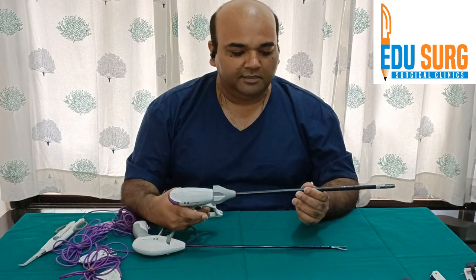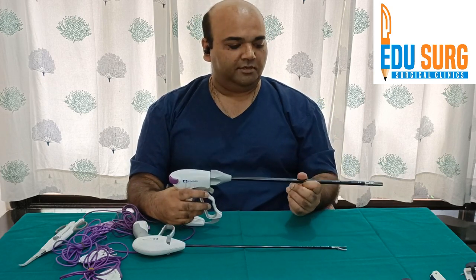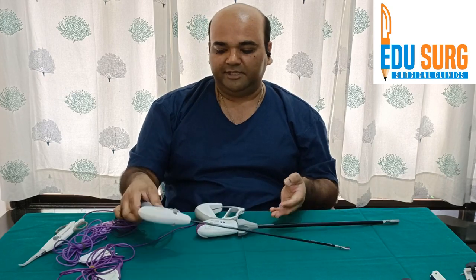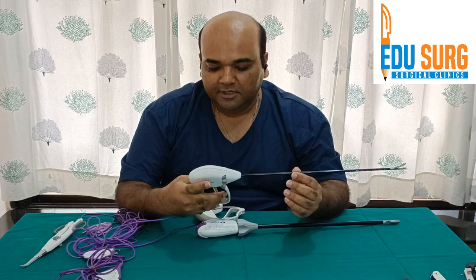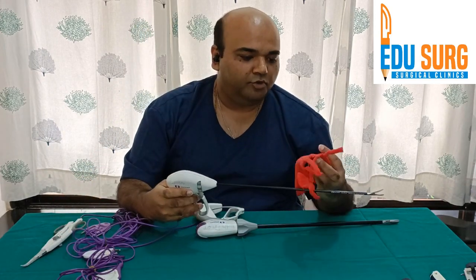As I have already said, this works on adaptive tissue technology — it is a bipolar device. Now let us see some of the parts of this device. We will start with the 5 mm model first. Suppose this is the tissue that you want to cut.